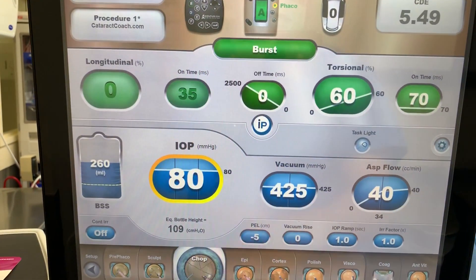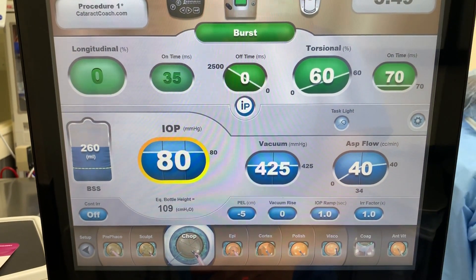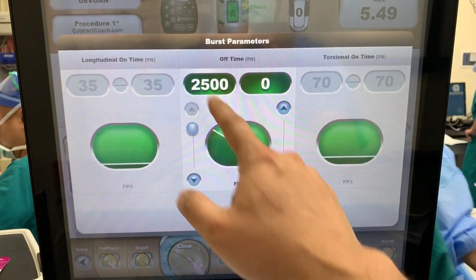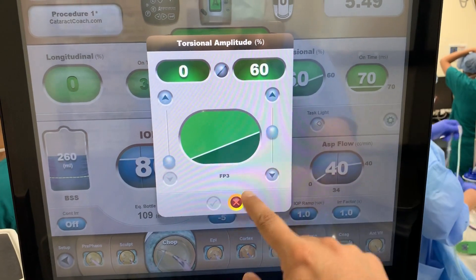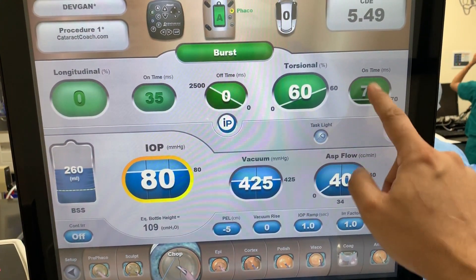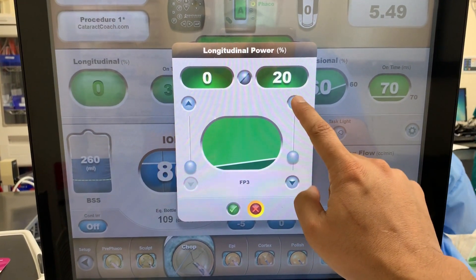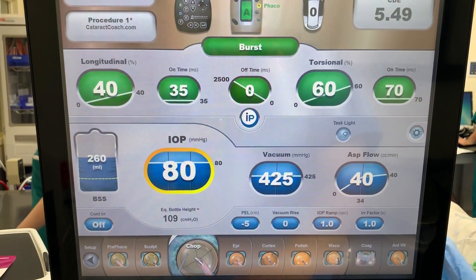You can also use burst mode. Burst mode is a natural fit for a chop mode. Here, we're starting off with a very long rest between bursts. We can have torsional here, and we can also adjust the duty cycle. We can ramp in a combination of longitudinal and torsional at the same time.